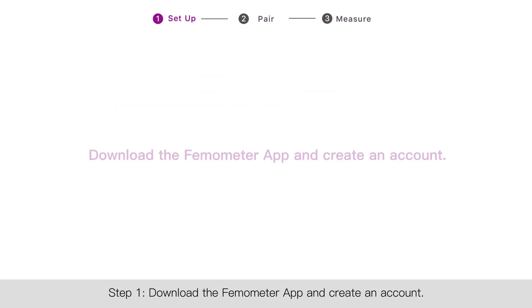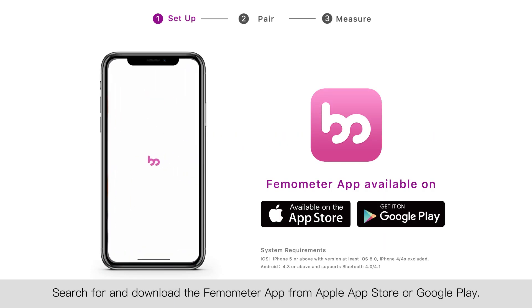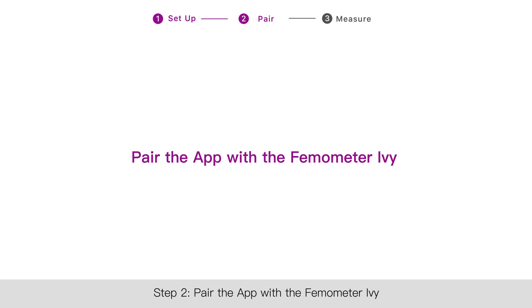Step one: download the Femometer App and create an account. Search for and download the Femometer App from the Apple App Store or Google Play. Create an account using your email address.